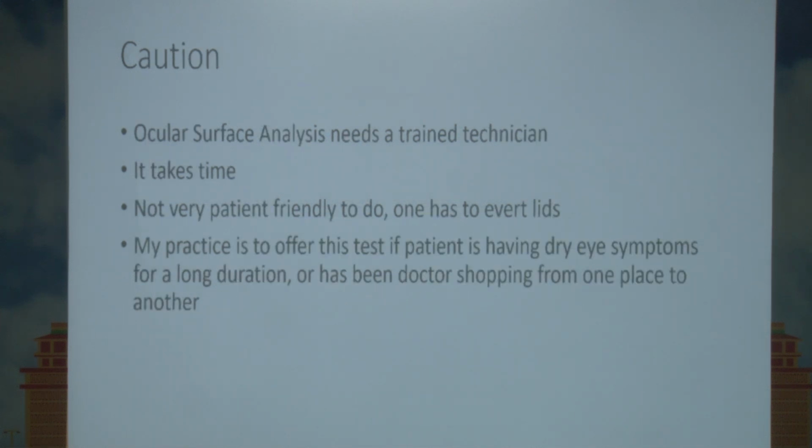The ocular surface analysis needs a trained technician. It can't be done by anybody. It takes time. It is not patient friendly because you have to evert the lids, the upper lid and the lower lid. And that is why in my practice what I do is that we are offering this test only if the patient has had symptoms of dry eye for a long duration, or if the patient has been shopping from one doctor to the other with symptoms of dry eye. We don't routinely do it in all patients who come with symptoms of dry eye to our clinic.